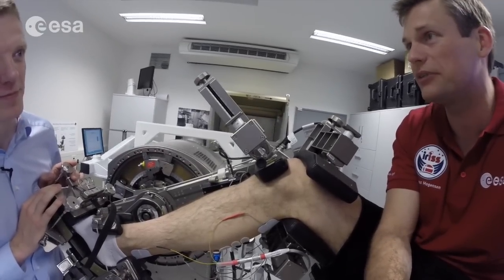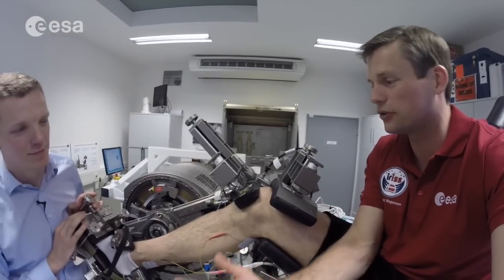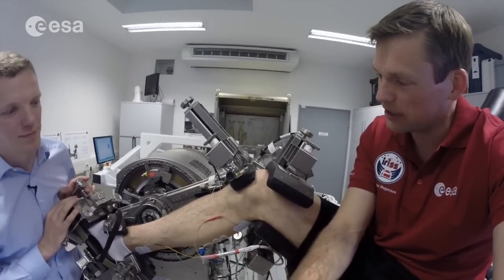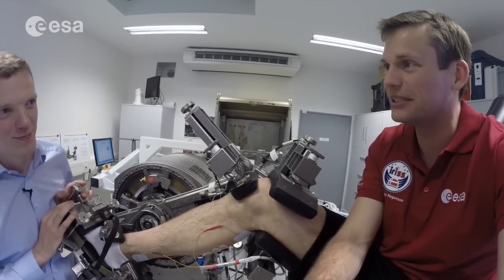I'll be spending at least two and a half days of my 10-day mission doing this MARES experiment — first setting it up, getting everything in place, and then being the test subject myself on it. So it should be interesting. Hopefully it'll be a success.